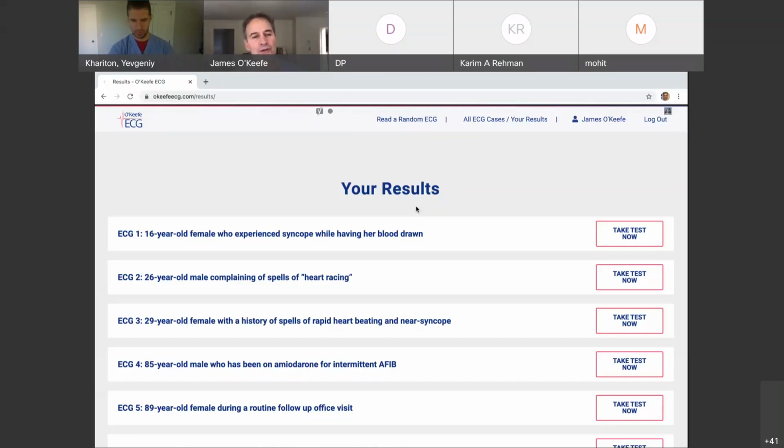So I'm going to show you some tracings that often occur. I've been doing this for decades, I think 3 decades, and I always ask the fellows after they finish their test what was represented. So I have a pretty good idea of the kind of ECGs that are going to be on there. It's important to pay close attention to the stem up at the top, the lead-in, the clinical scenario, as it is in the clinic or in the hospital. On the boards, they will definitely give you clues about what this might or might not be. So anyway, okay, let's go ahead.